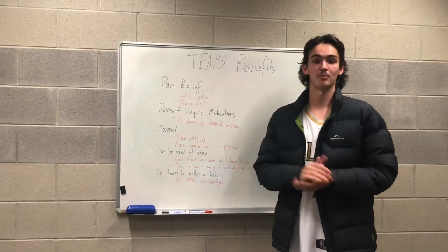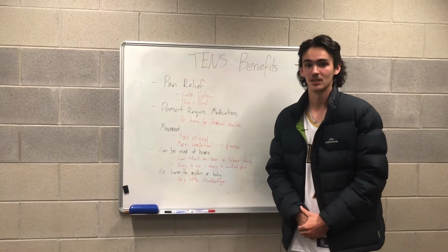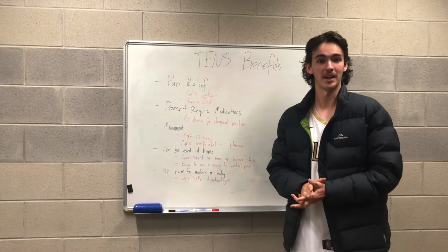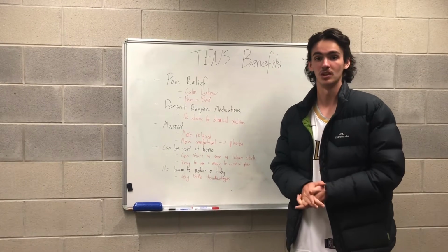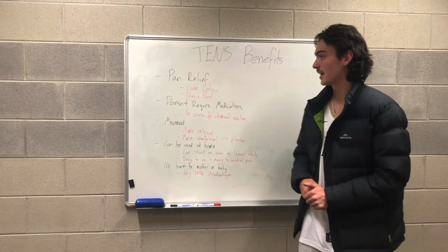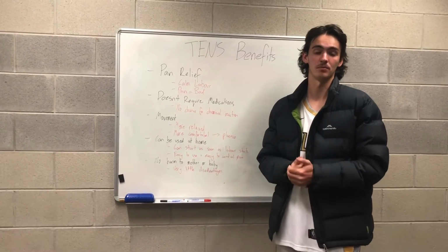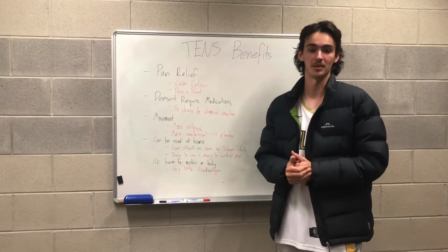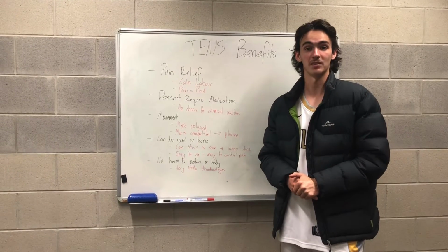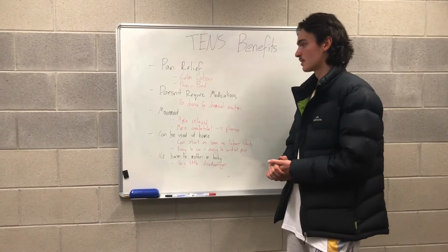The first of these, probably the most obvious of them all, is the pain relief that the patients will experience. During labour, its main role is to limit the amount of pain experienced throughout contractions. So it will contribute to patients experiencing a much calmer labour as they have the ability to control or at least somewhat limit the amount of pain they're experiencing. And as we know, pain is probably just not a great experience to go through, so to be able to limit that as much as possible is ideal.